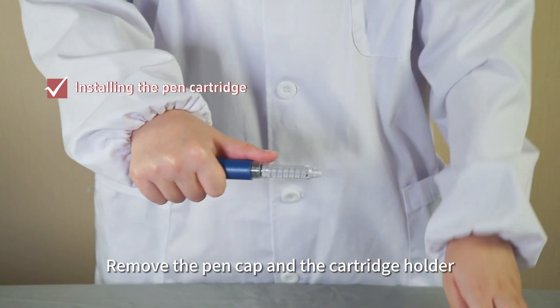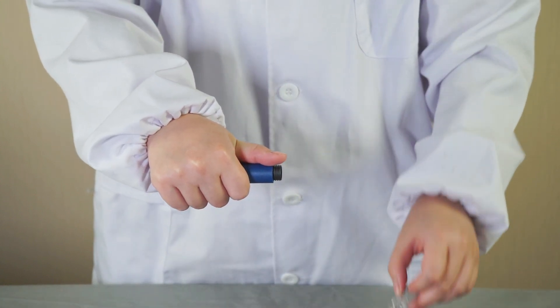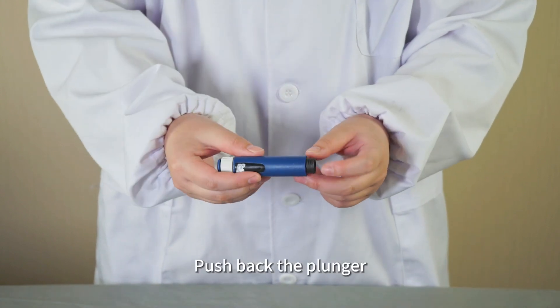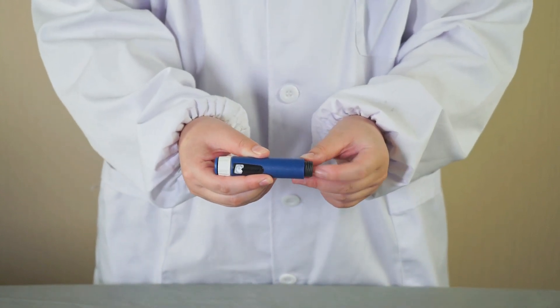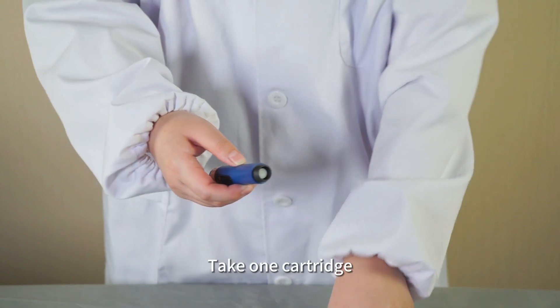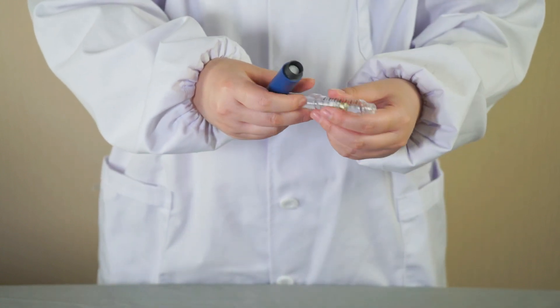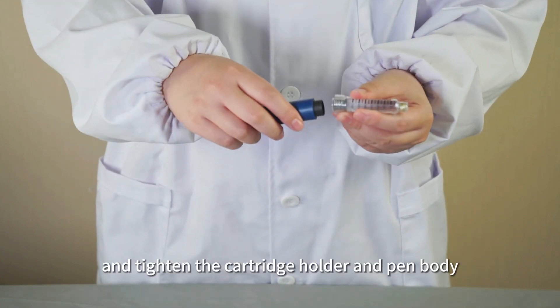Remove the pen cap and the cartridge holder. Push back the plunger. Note that the plunger of a new pen may not extend. Take one cartridge, insert it into the cartridge holder, and tighten the cartridge holder and pen body.